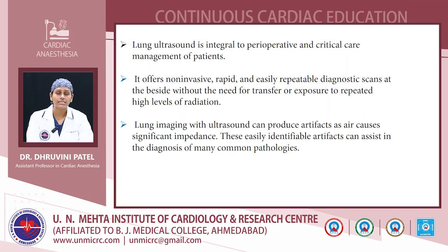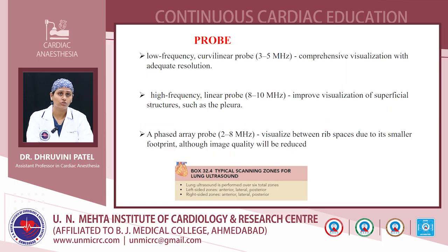Lung ultrasound is integral to perioperative and critical care management of patients. It offers a non-invasive, rapid, easily repeatable diagnostic scan at the bedside without the need for transfer or exposure to repeated high levels of radiation. Lung imaging with ultrasound can produce artifacts, as air causes significant impedance. These easily identified artifacts can assist in diagnosis of many common pathologies.